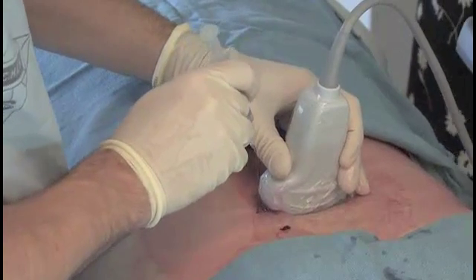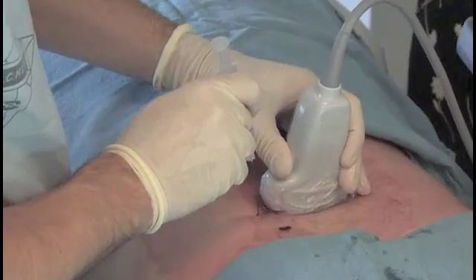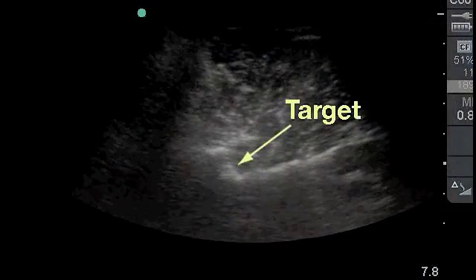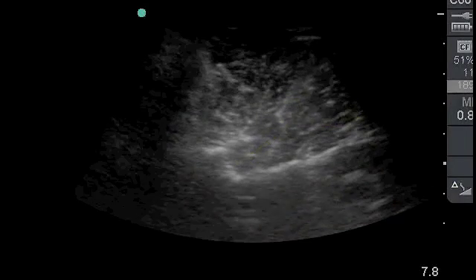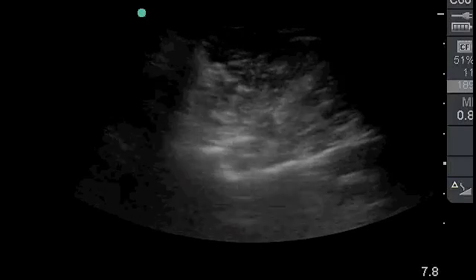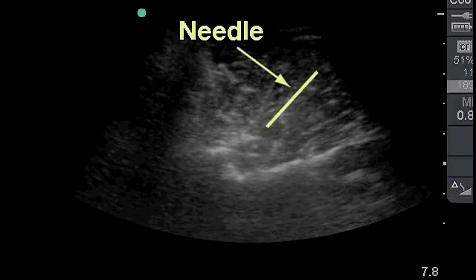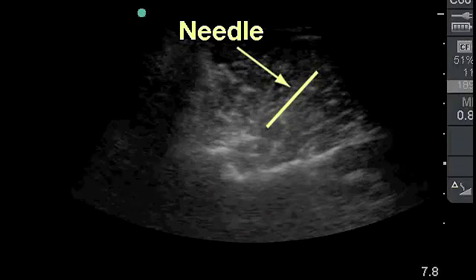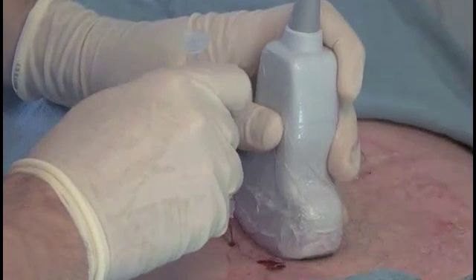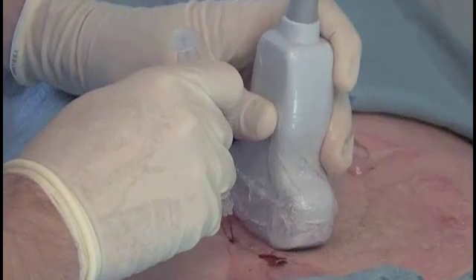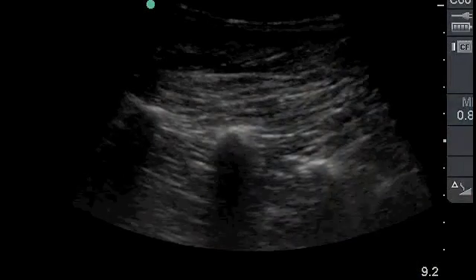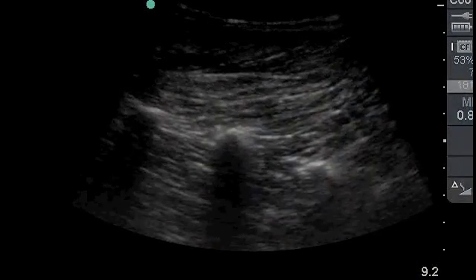Using real-time ultrasound guidance, the needle is advanced towards the target point, which is the groove at the superior margin of the transverse process or adjacent to the corresponding superior articular process of the vertebra. The spinal needle can be visualized as an echogenic linear foreign body. After bone contact is made, a longitudinal paravertebral view is obtained to verify the needle tip position at the cephalad margin of the transverse process.